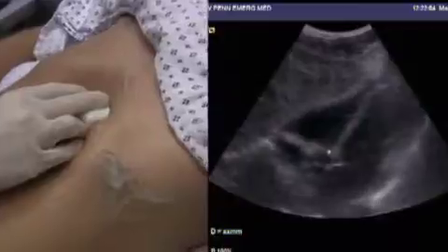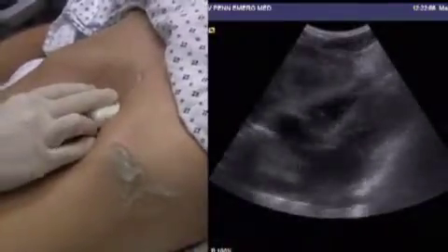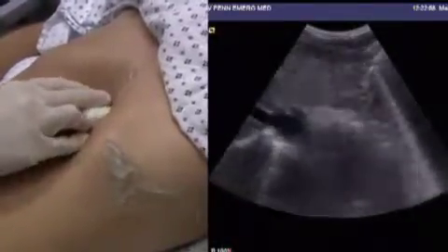Sub-xiphoid, adjust depth. Anterior and posterior pericardium, all the way from top to bottom.